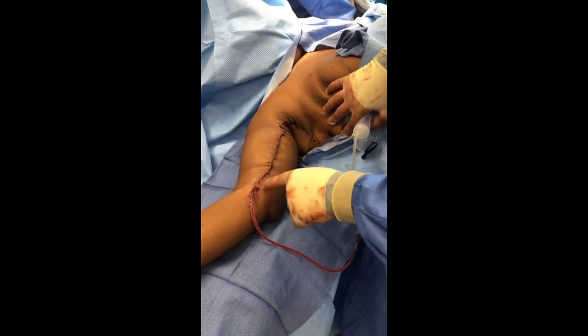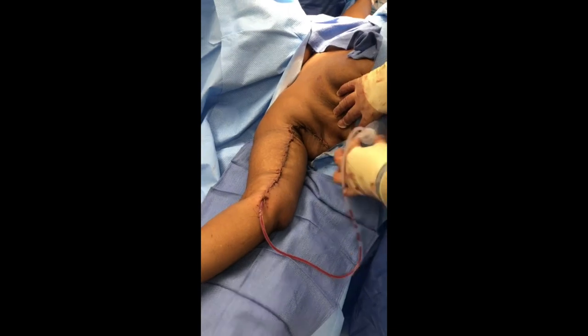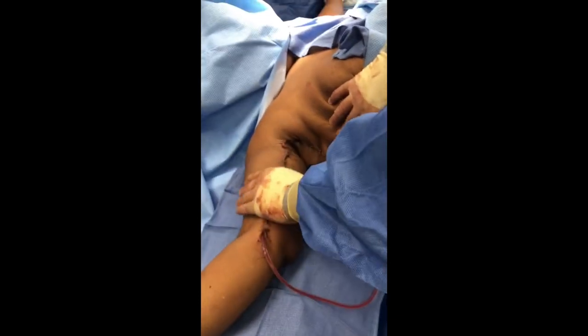Here's the final product. You can see we have our incision from the elbow down into the armpit area. I've got a drain coming out here. You can see all that loose skin is now gone from the back of the arm — some beautiful results here.